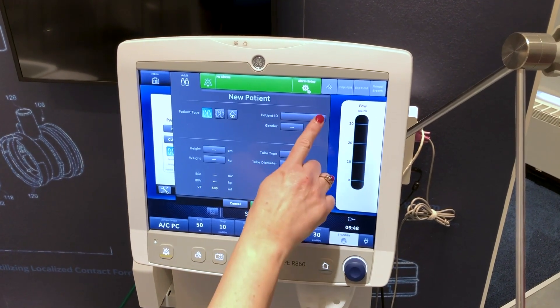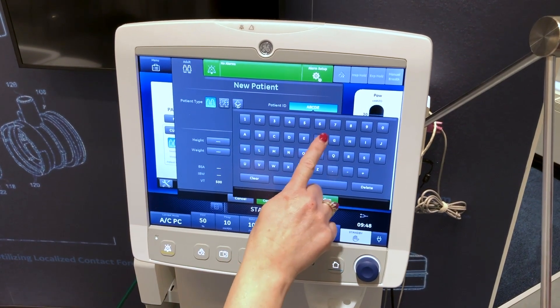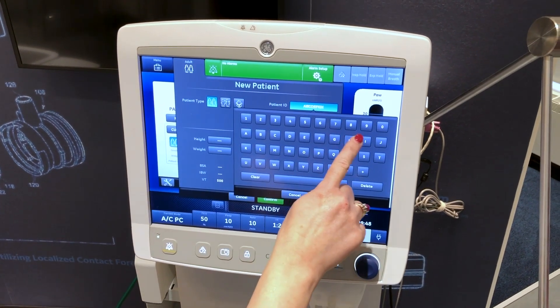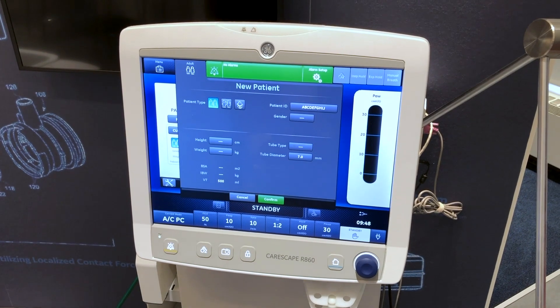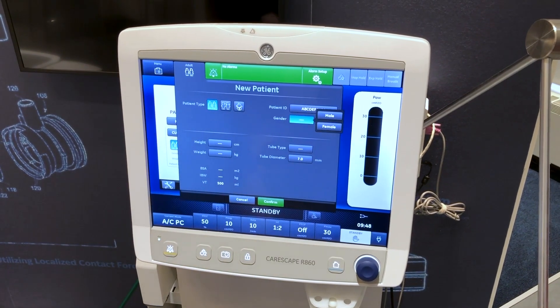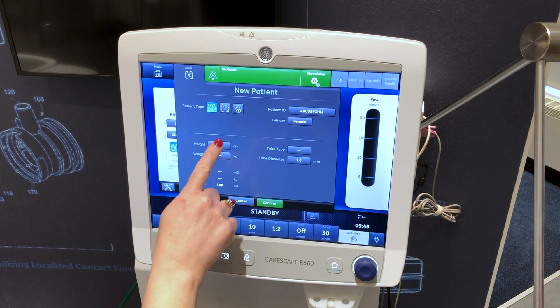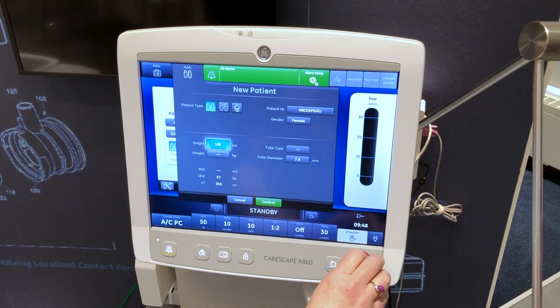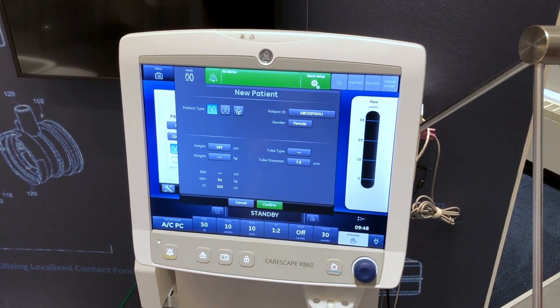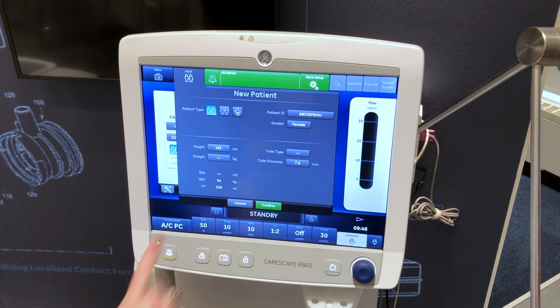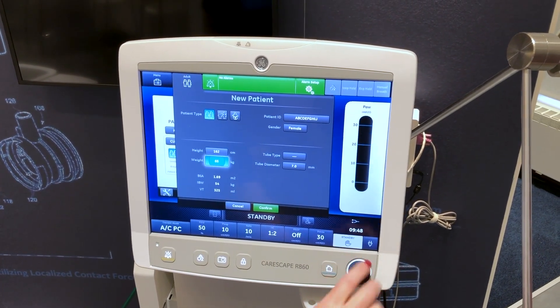Select patient ID if necessary, enter up to 10 characters, and select confirm. Select the patient's gender. Select height and dial in the patient's height in centimeters. Select weight and dial in the patient's weight in kilograms.